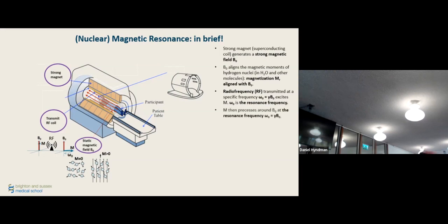And if we then see what happens to this magnetization, the magnetization starts precessing or revolving around the lines of the external magnetic field, as if it were like a top or a gyroscope that revolves around the magnetic field at exactly the same frequency at which we apply the radio frequency field. And this frequency is called omega naught, or the Larmor frequency.